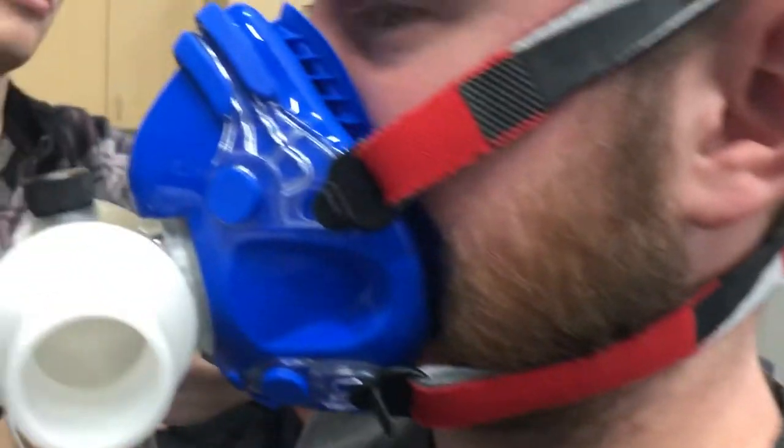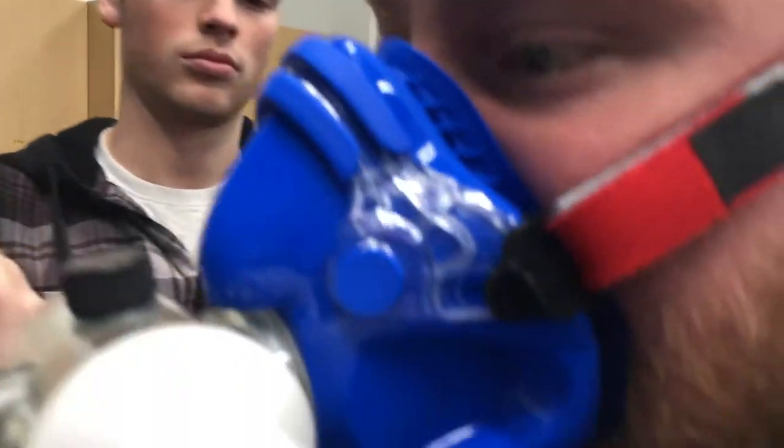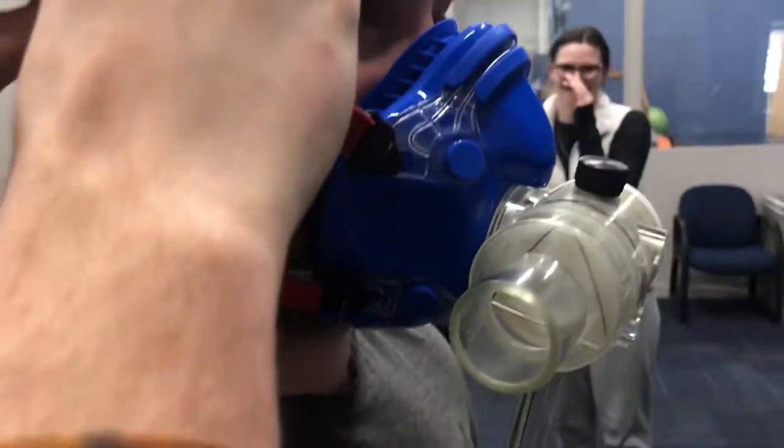We want to make sure there's a good seal around his whole mouth, because if there's not, the VO2 max test won't be as valid.